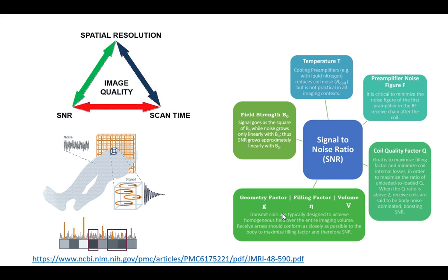So tightly packing is awesome, but that means crosstalk is going to be bigger too. So to improve my spatial resolution, I've got to worsen my signal to noise ratio because that overlap is going to create more noise between them. Even if it's off, that coil is still going to read some, and then I'm going to get some back from it. So there's always a little bit of back EMF created between that coupling.